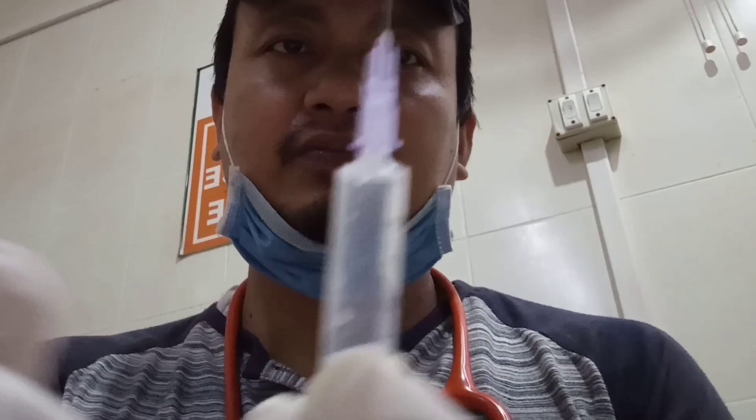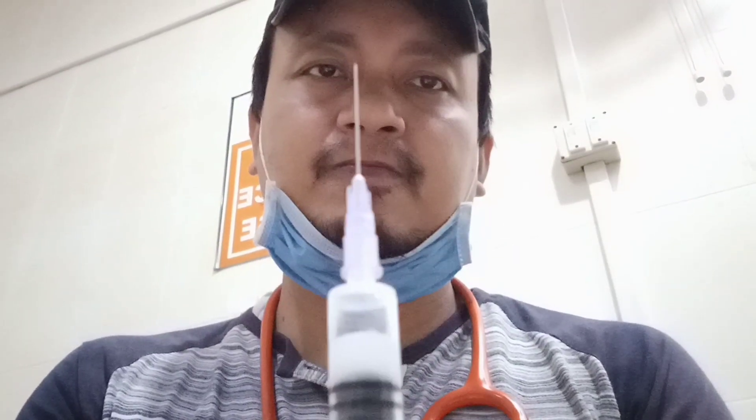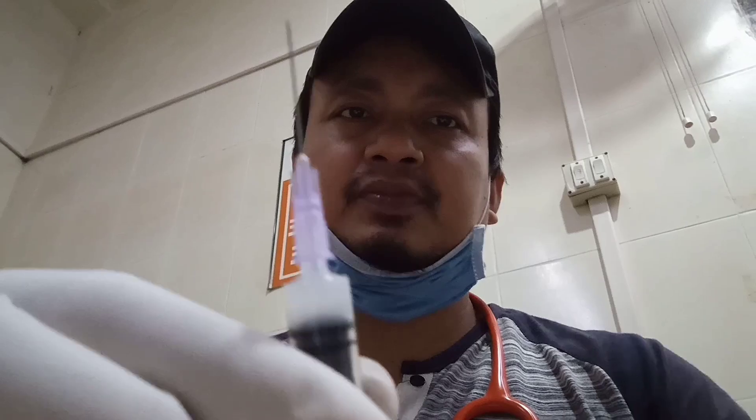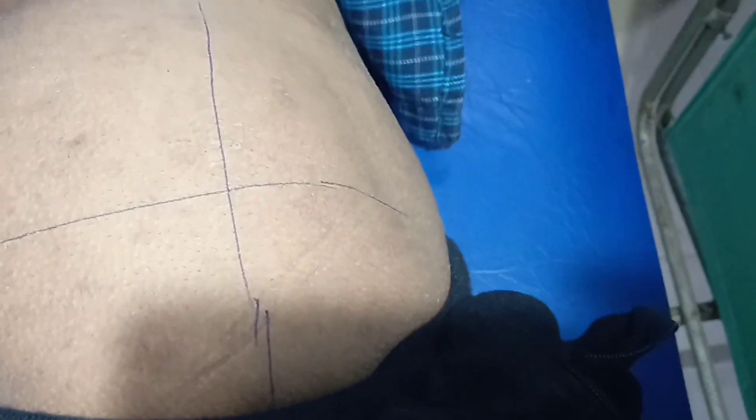I will inject it in the right buttock. I have divided it into four quadrants, and I have already cleansed it with a spirit swab. I'm going to keep this injection in the outer quadrant of the buttock.